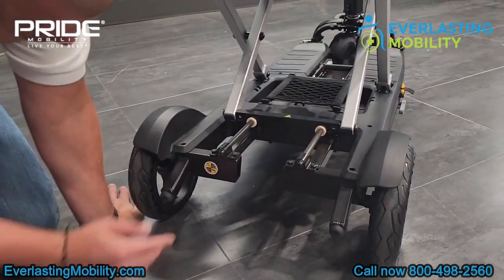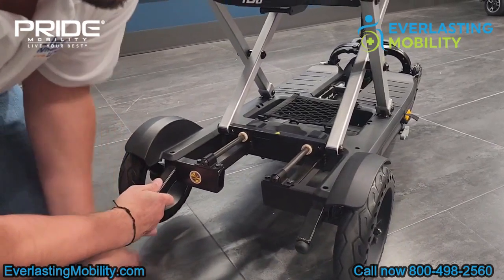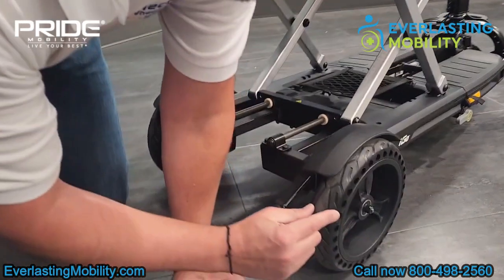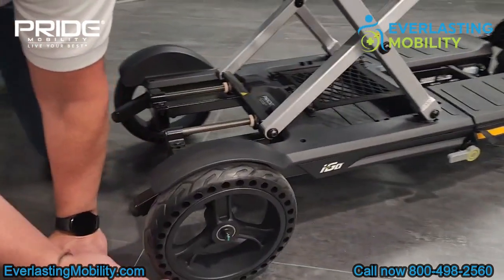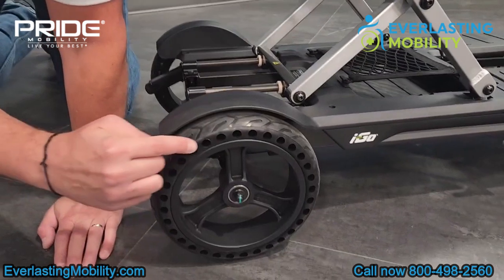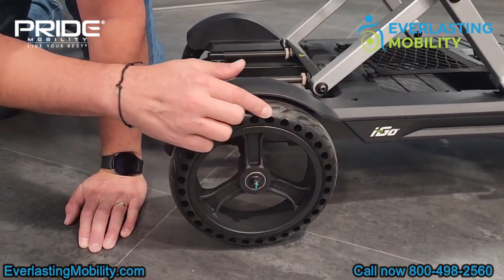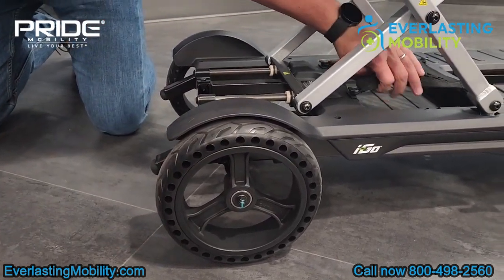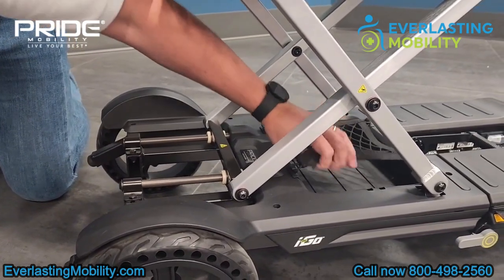Another really cool feature about this scooter is the flat-free tires. There's no air in these tires, but there are holes that are drilled in them, giving a little give similar to a pneumatic tire — but you don't have to worry about getting a flat tire. That's pretty cool technology that Pride has added to this scooter and a few others. There's also a storage area right beneath the seat with a net over top to secure your belongings.